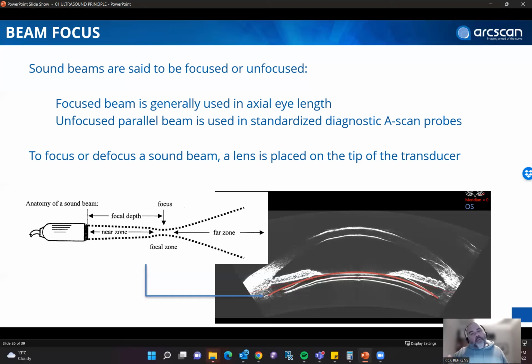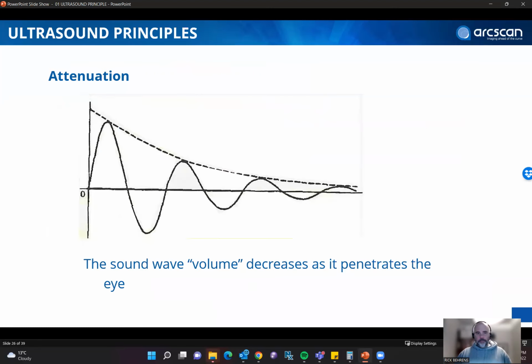We don't do that because our capability is only to focus on one area, and we focus on the area of study. Looking at the cornea when we are focusing to do an ICL is a waste of talent, a waste of time, and a waste of focus. That's why you're going to see the Scout scan, which allows you to quickly position the focus of the image in a much better position.